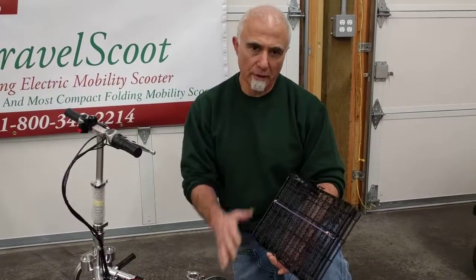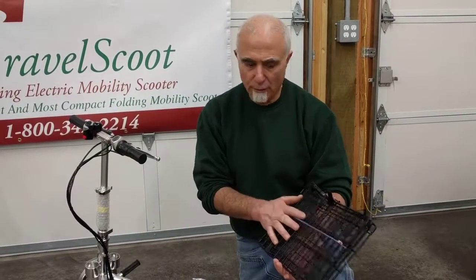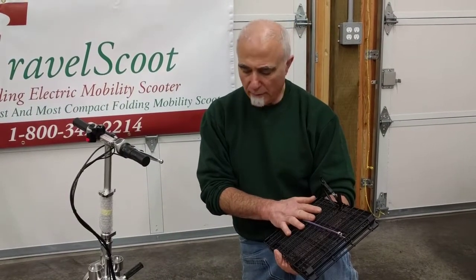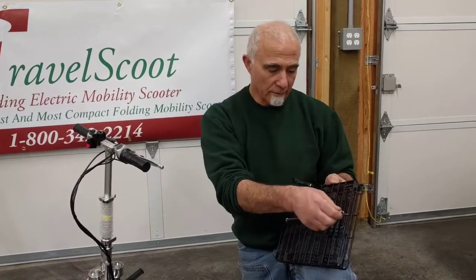Hi folks, this is Tony at TravelScoot again. Today we're going to show you how to install the basket on the back of the TravelScoot Mobility Scooters. You have the same basket, front or rear. We've shown you how to install it on the front. The rear is similar, perhaps a little simpler, because the battery is actually supporting the basket. So let's get started.